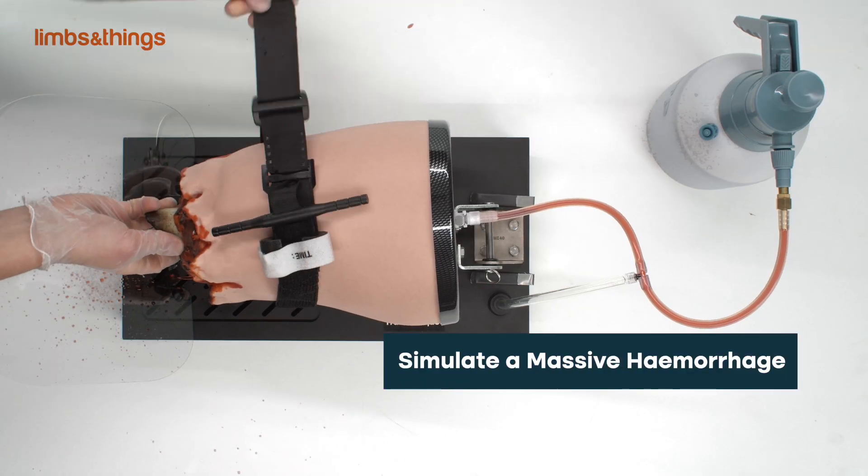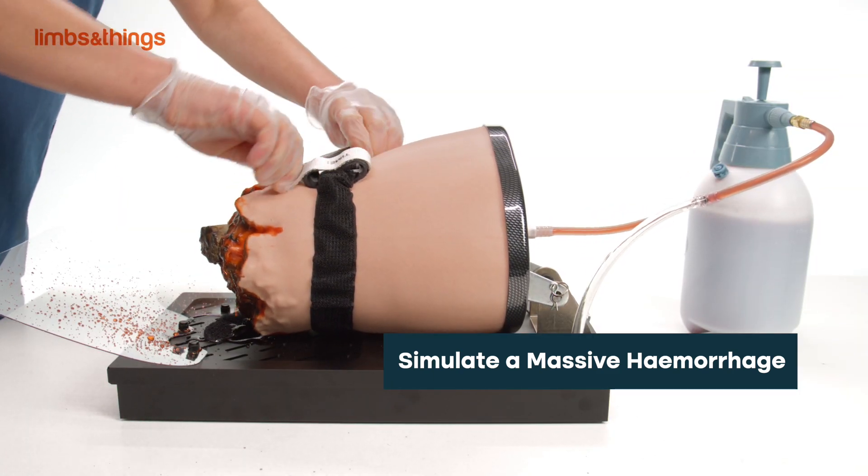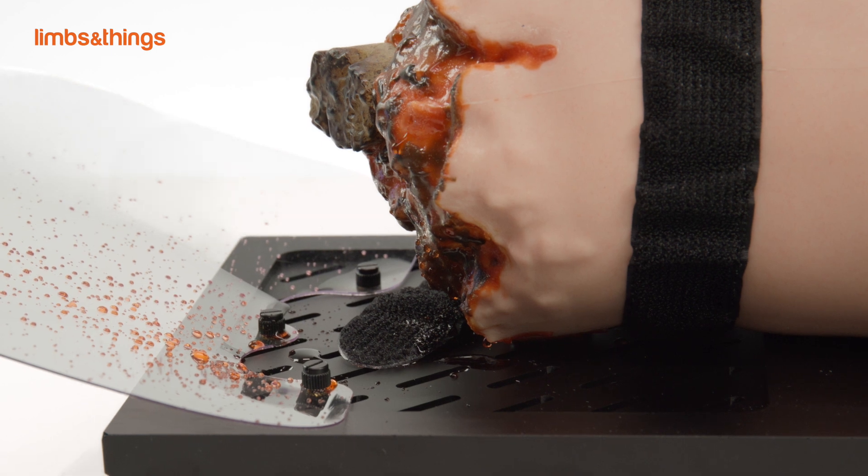Users can simulate a massive hemorrhage when the product is connected to the pressurized blood supply, and visual feedback is provided when the correct tourniquet force has been applied.